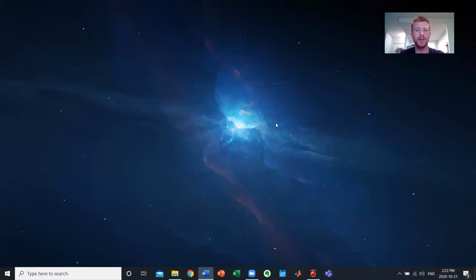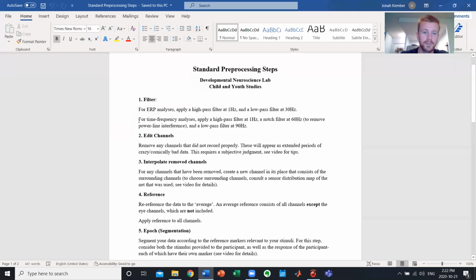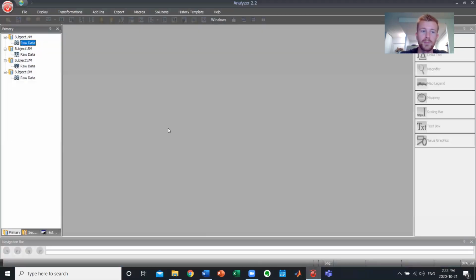So hopefully now that you've gotten a chance to move around in VBA and you've had a chance to upload all your raw data, we're going to look at some of the first pre-processing steps we're going to apply. The first three that we're going to be looking at in this video are filtering, editing channels, and interpolating the channels that we've edited. So we're going to go ahead and open back up VBA.